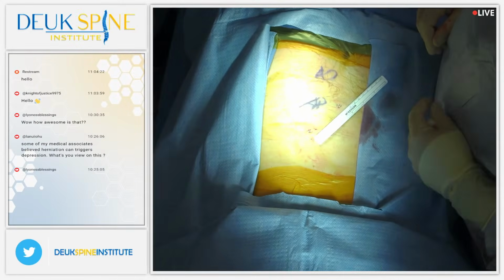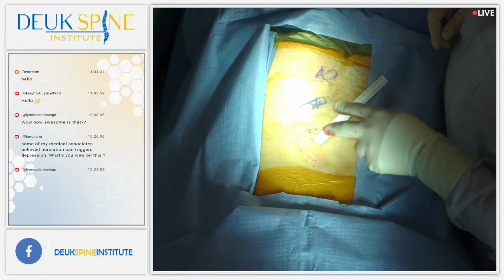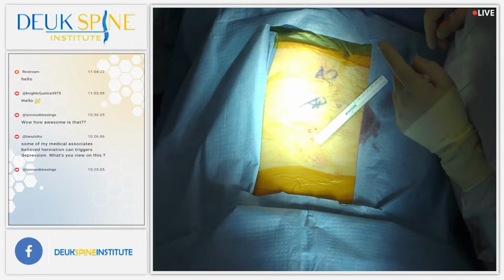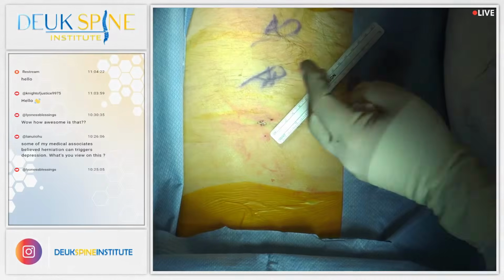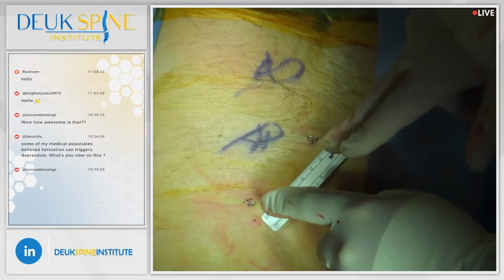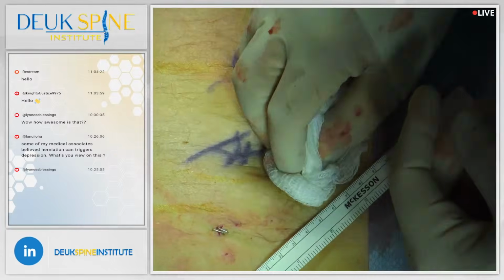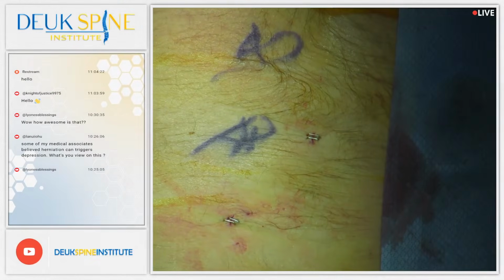Questions? This patient had facet joint pain in his lower back, causing chronic back pain at L4-5, L5-S1. He had SI joint, right sacroiliac joint pain. So we treated both the facets and the SI joint today. And all of this is done minimally invasive. There's virtually no bleeding. We lost maybe 2 cc's of blood. And he's going home in about an hour.